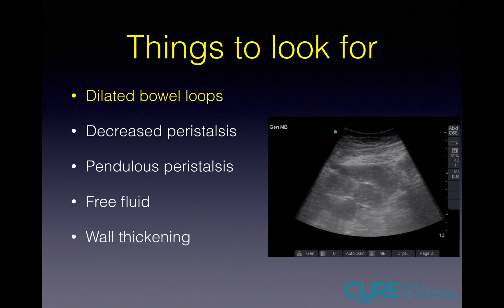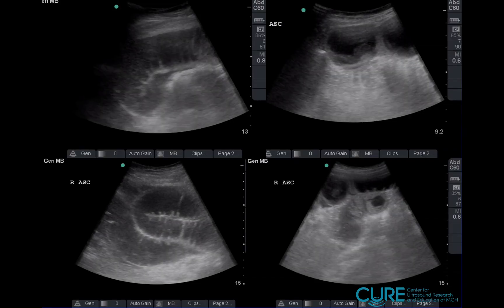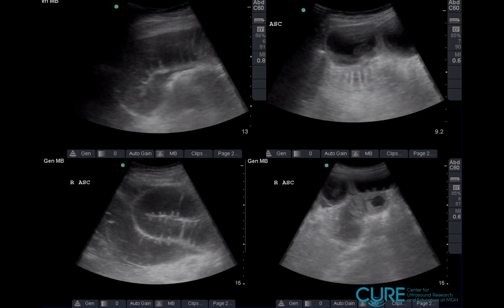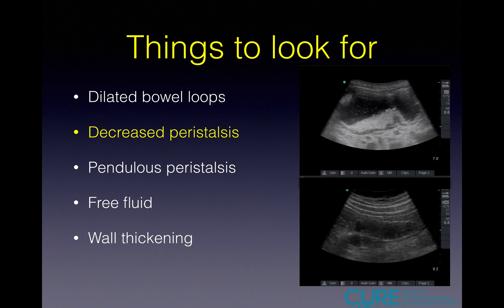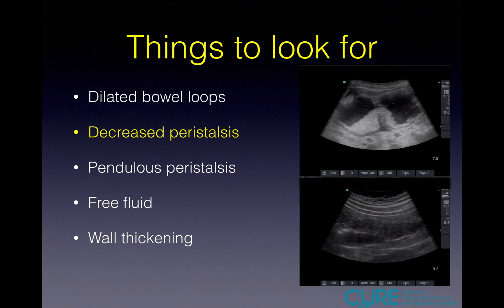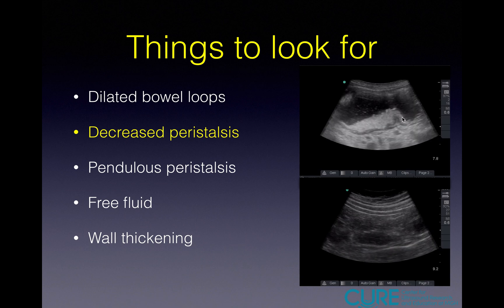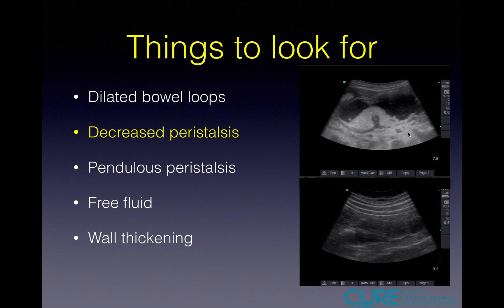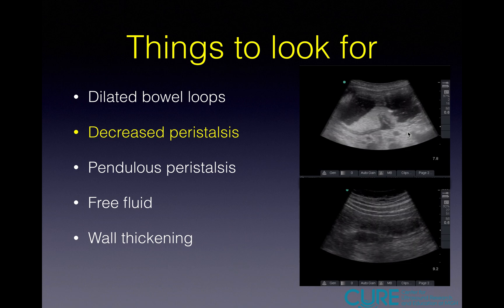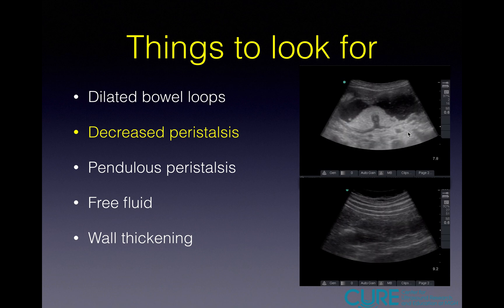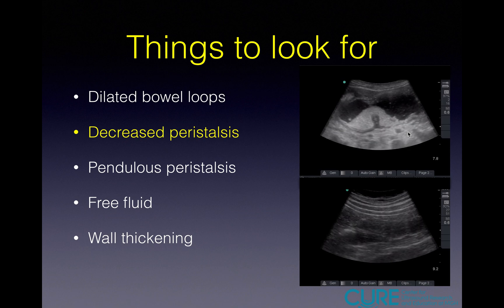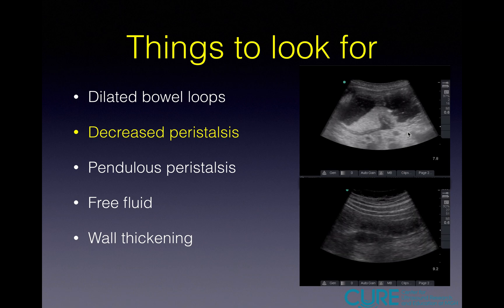First, dilated loops of bowel — more than 2.5 centimeters, as was seen in the patient we discussed initially. Next is decreased peristalsis. Normal peristalsis shows the smooth muscle of the bowel just plowing the contents down like a bulldozer. Looking for the absence of peristalsis is something we assess when looking for bowel obstruction — it can help differentiate from ileus. Ileus should have no peristalsis, while decreased but present peristalsis is more likely to be bowel obstruction.